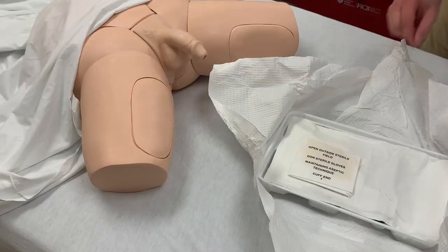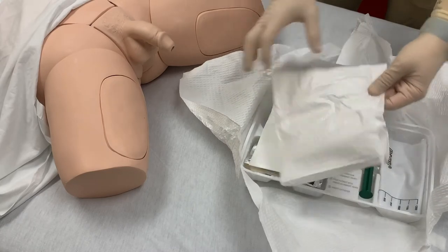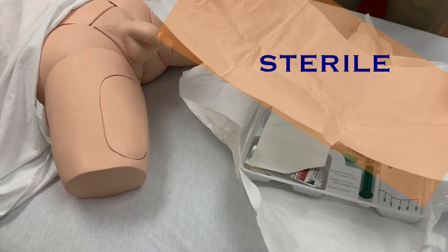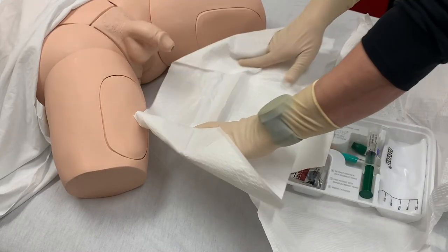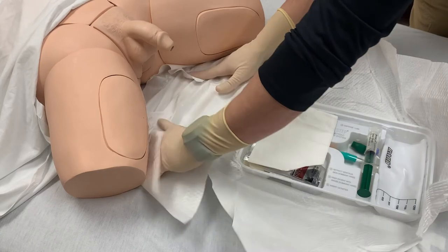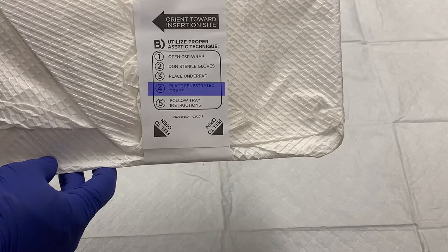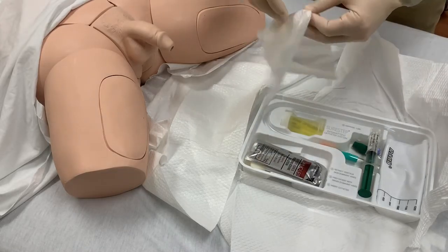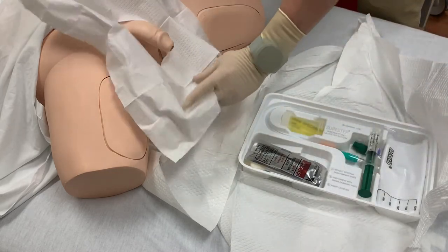Don sterile gloves — they are the next item in the package. Place the under pad. This drape should be placed under the patient's legs, up against their buttocks. This pad is sterile and will provide you with additional sterile field, but be careful that your hands do not touch the patient's skin while placing this pad. One way of accomplishing this is to wrap the corners of the pad around your hands and use that as a protective barrier between your sterile hands and the patient. If you do touch the patient, your glove is no longer sterile. Place the fenestrated drape — this drape has a hole in the center, and the hole should be positioned over the insertion site, providing additional sterile field that will completely surround the insertion site.